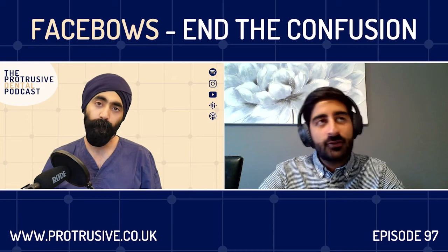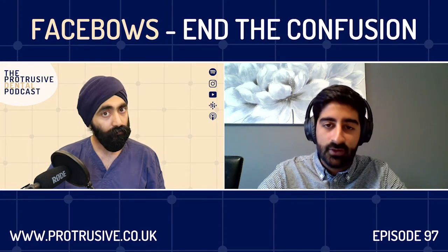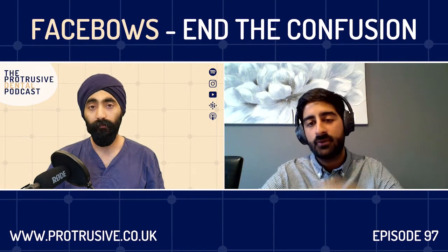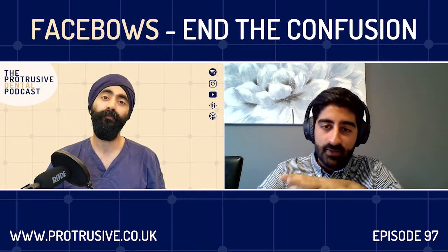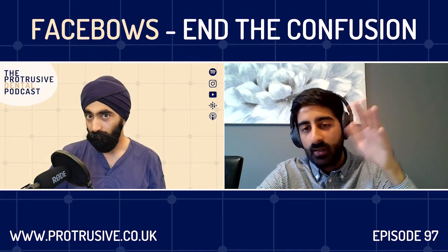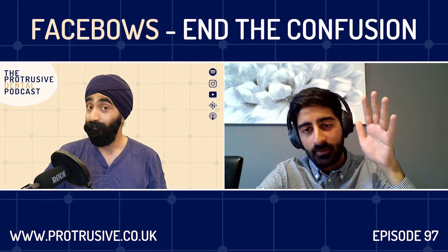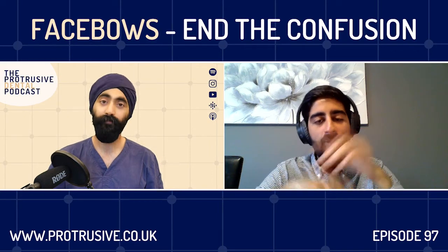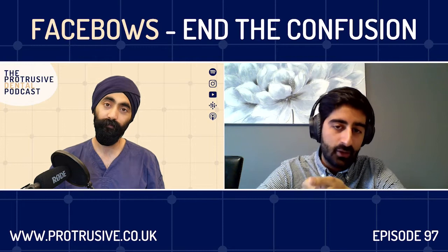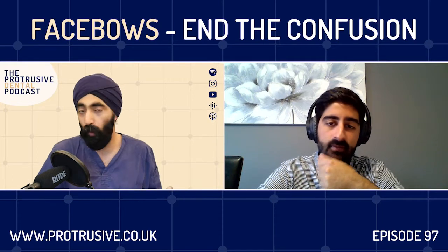So for me, the first one is articulating study casts before I'm planning a full mouth reconstruction. If you've got a patient who comes with tooth surface loss and you send your technician just the upper and lower casts to articulate together, you need to know how they move in dynamic relationships. If you're planning on raising the OVD and you're going to open up the articulator pin, you need to have some kind of relation between those teeth and those jaw joints at the back. So if I'm planning any increase in OVD, then I'll be taking a Facebow record. So that's the first one. Essentially, when you are reorganizing, that's automatically a Facebow, which makes total sense.